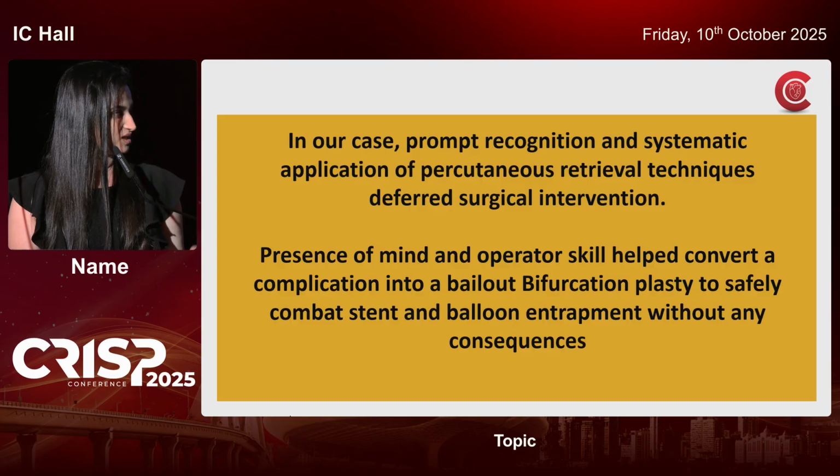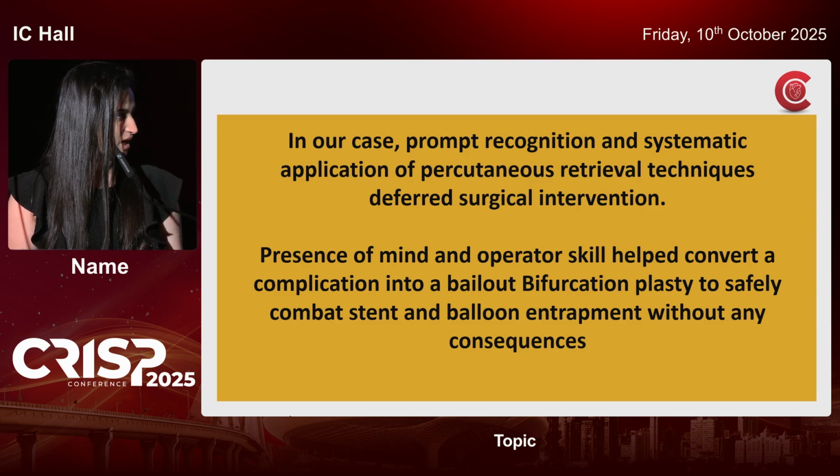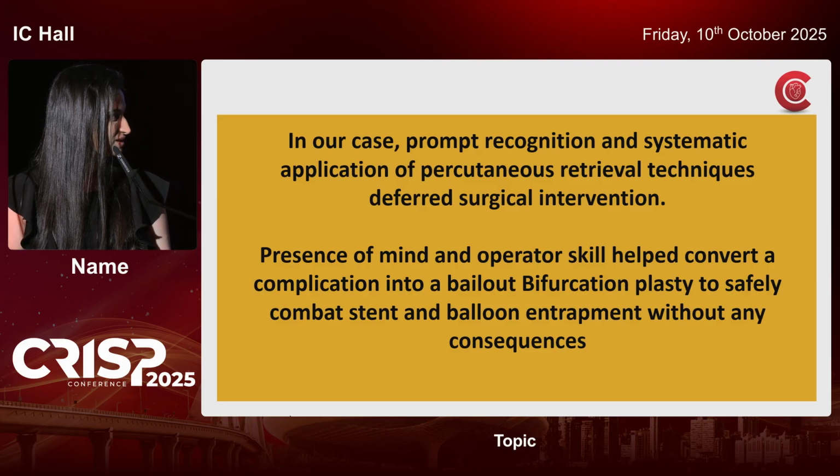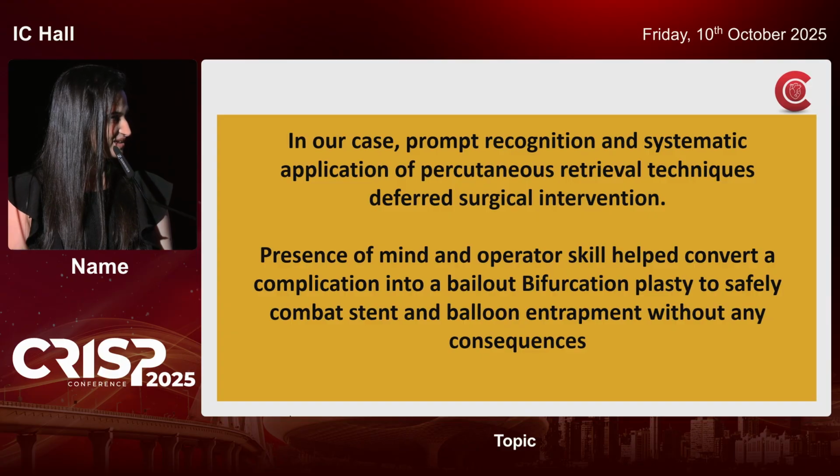It was probably because of the underinflated stent struts. There is a big calcium plate beyond the stent. The stent is underexpanded. Will that 3 millimeter NC balloon work over here? So we should have used imaging techniques probably. There is a calcium plate. So what if you have no financial constraint, what will help here in this patient? An IVL. Because not even a cutting balloon, nothing will work actually. However, we had financial constraints.